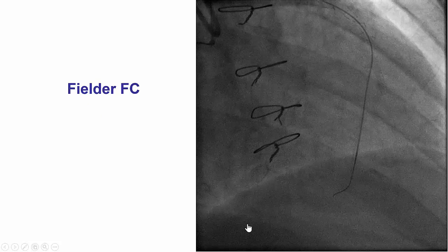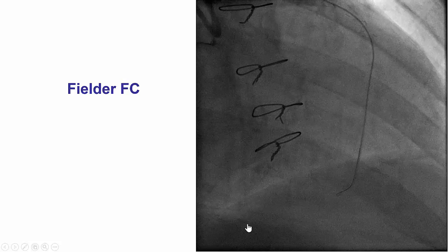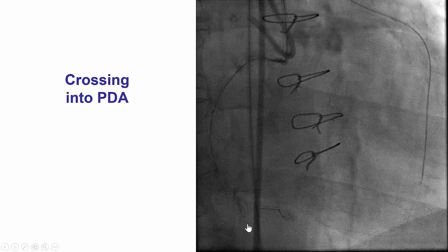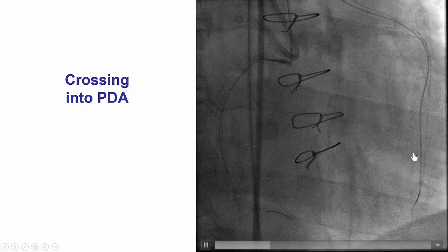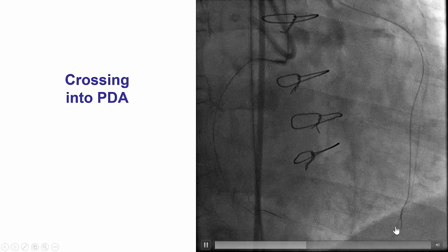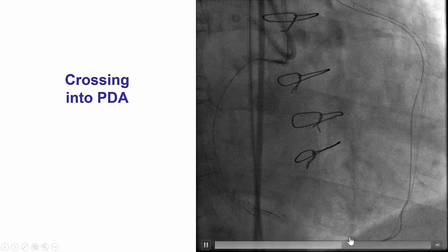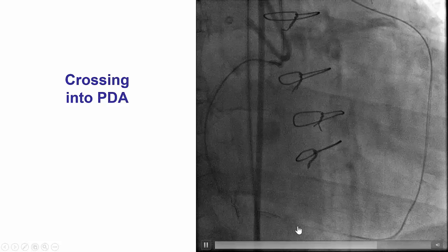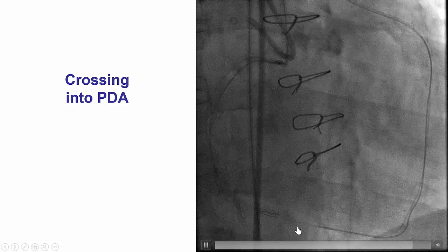After doing that, after several wire attempts with the Sion wire as well as the Fielder FC, we were eventually able to advance the wire into the occluded vessel. The Corsair Pro could then be advanced relatively easily through the collateral into the posterior descending artery, providing a very strong position for retrograde crossing attempts.